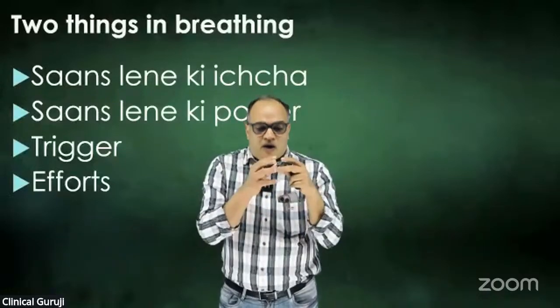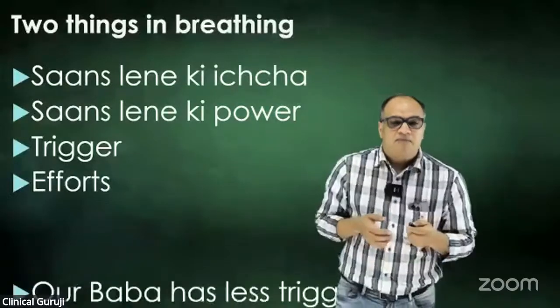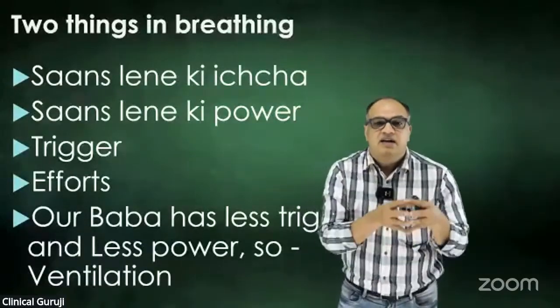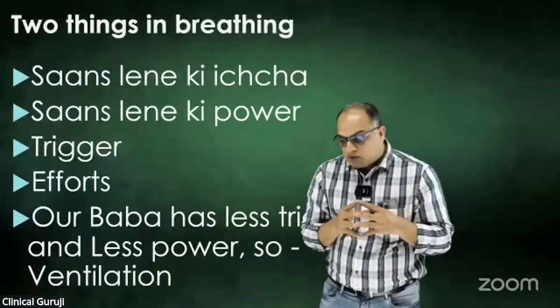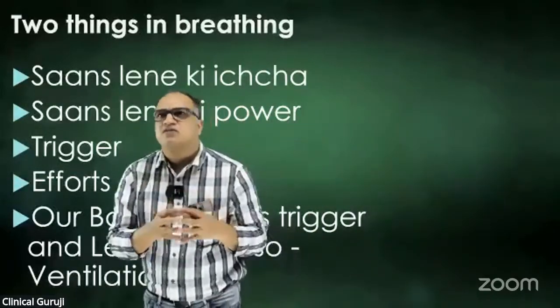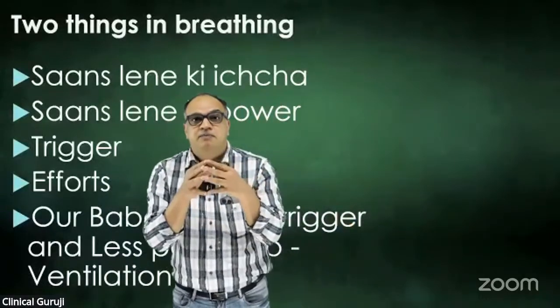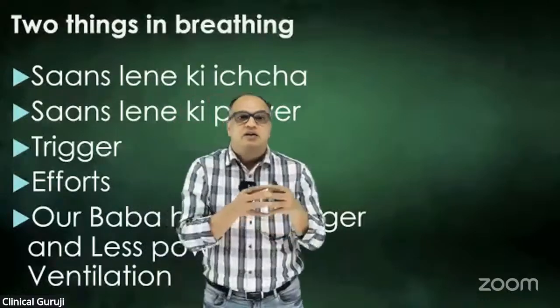Somebody who has less trigger and less power, somebody who is hit on head, he is not breathing enough, he is not having a good tidal volume, he is not having a good respiratory rate, he doesn't need oxygen.